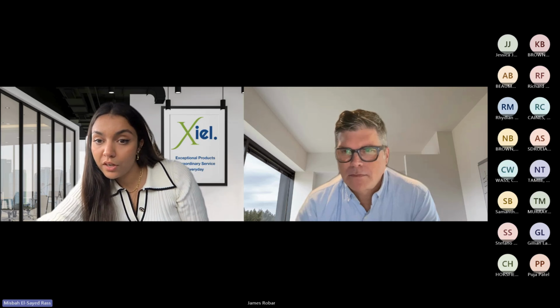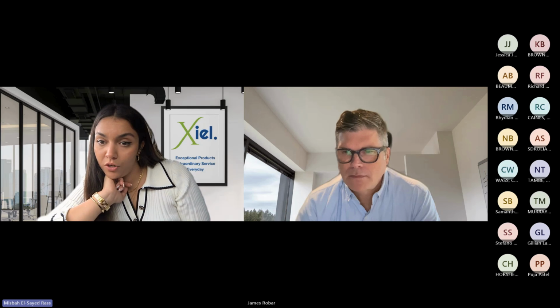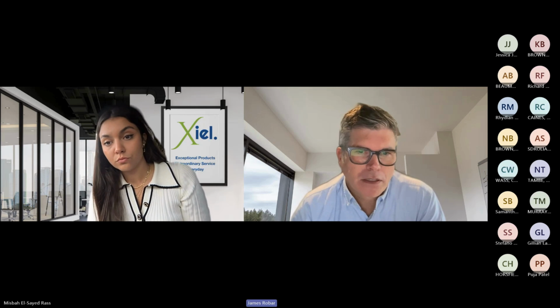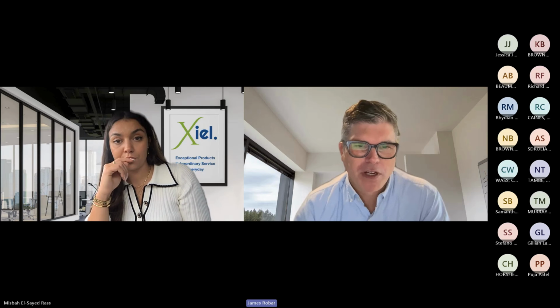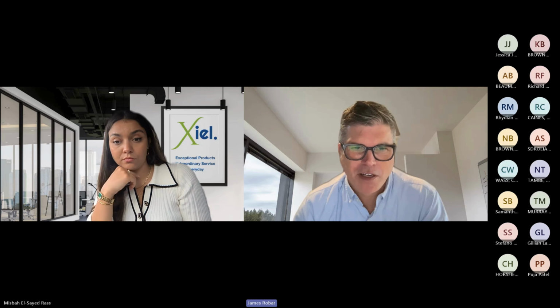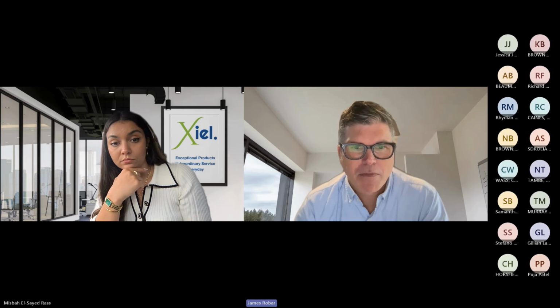So we've just got some more in the chat now. Stefano, do you have any PTV volume constraint for using DermaPlan? Not on volume, but on depth. The goal here was a suitable and maybe superior replacement for electron beams. As a rule of thumb, we're putting a limit on the deepest volume that you would otherwise treat with an electron beam. If your highest electron energy in the clinic were 16 MeV, let's say, to get decent falloff with an electron beam, then you're looking at 3 or 4 centimeters depth.